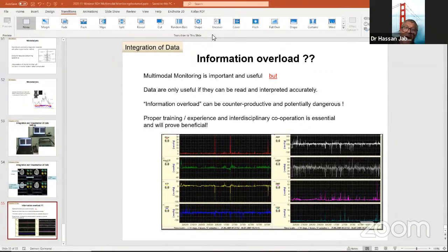Because if you have a probe, and the ICP goes up, you have to do something anyway. And what would you do? You would probably put in a drain. So I leave the drain in, close it, and in case there's trouble, I open it again. That's it. And then it takes one clip. Otherwise, if you put a probe in and the ICP goes up, what are you going to do? You have to drain the CSF.